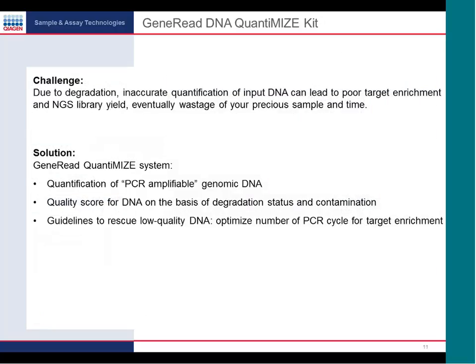So that was about the panels, but to have really good target enrichment using those gene panels, it's very important to have proper or accurate quantification of input DNA. Otherwise, it's like garbage in, garbage out.